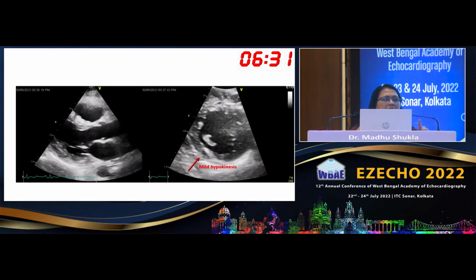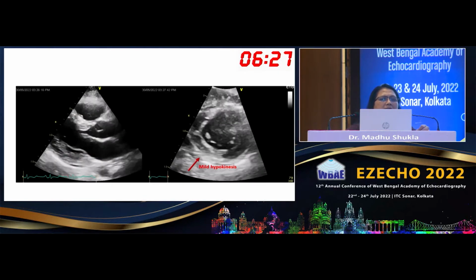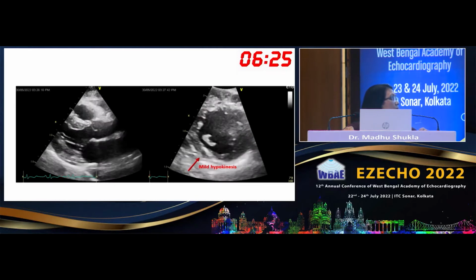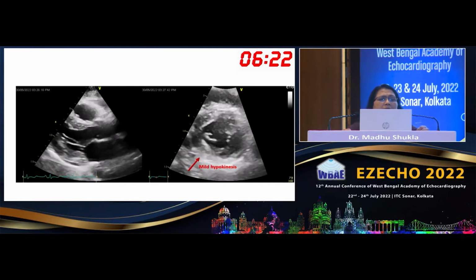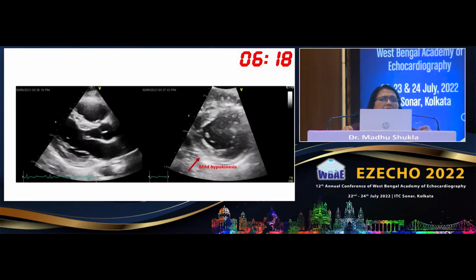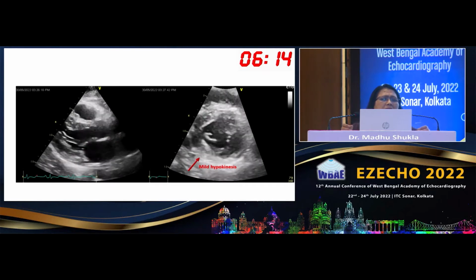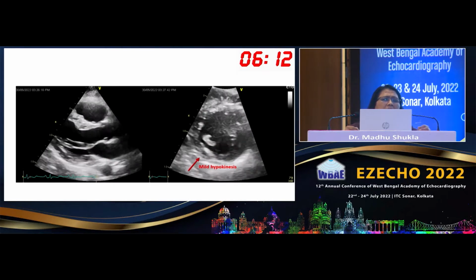That ECG was done by us. Then we did the echo ourselves. And this is on the left side, you have a parasternal view. And you can see in the basal inferolateral wall, posterior wall, there is some hyperechogenicity showing some edema here and pericardial effusion.